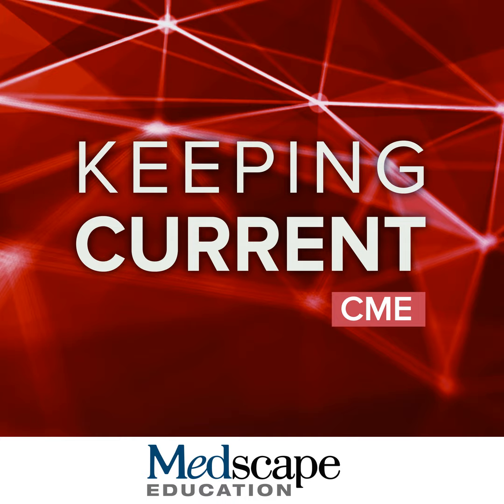Recently, some contrast agents with ultra high relaxivity have been made available and approved by the FDA. And one of the advantages of those contrast agents is that you can administer a smaller dose of gadolinium and get similar, if not increased, enhancement compared to a regular dose of regular gadolinium contrast agent.